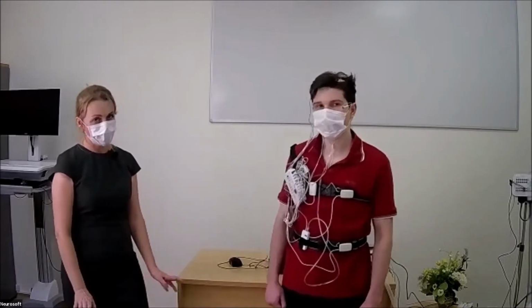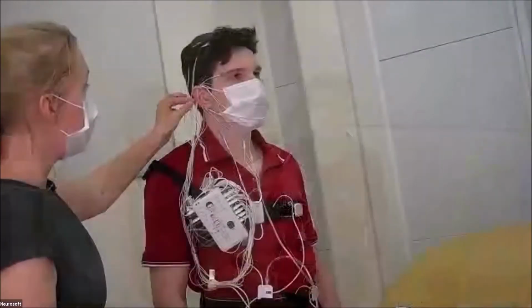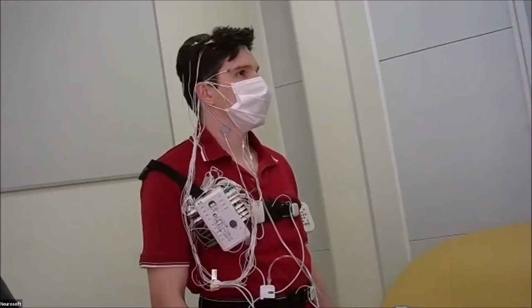For electroencephalography, we recommend using cup electrodes with electrode paste, and there are different ways to fix these electrodes. It could be 10-20 paste, it could be medical tape or collodion, as you like. It's very important to put the ground electrode on the patient, and here I put the ground electrode. It's the green wire.